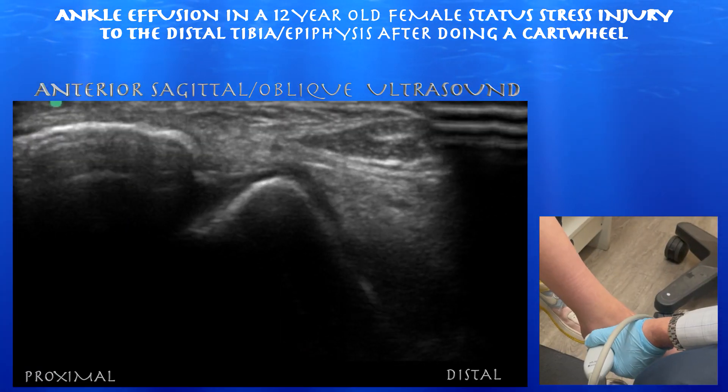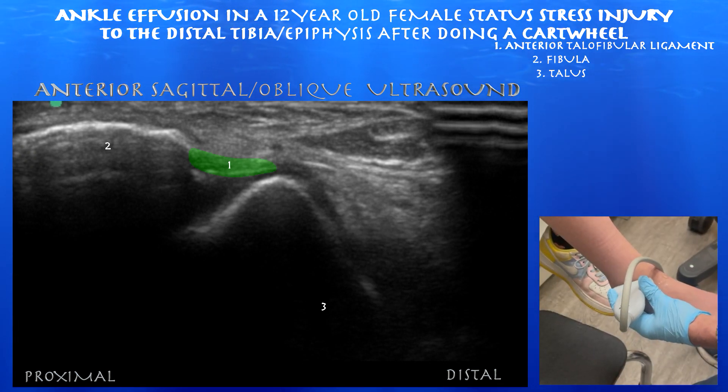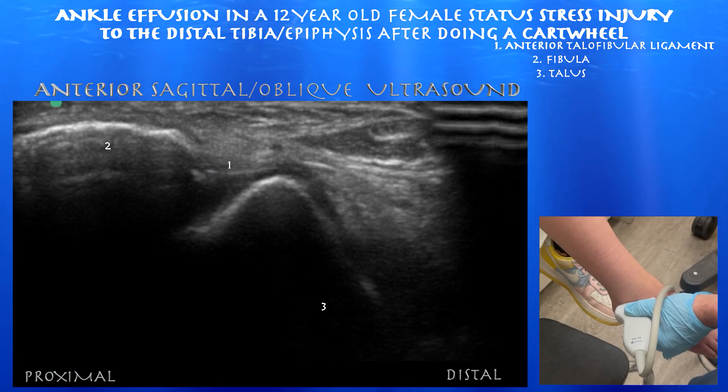And now we're going to look at the ATFL. We can see the anterior talofibular ligament spanning between the distal fibula and the talus, and it looks intact.